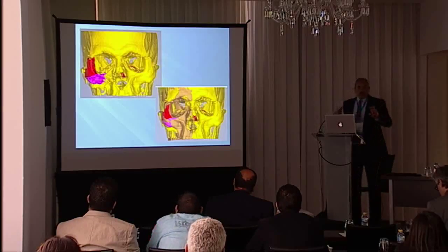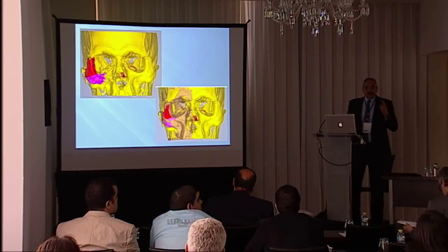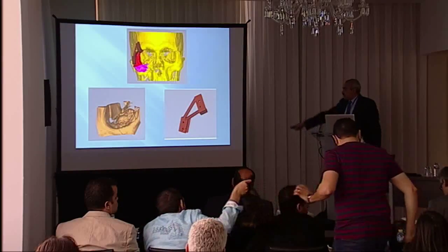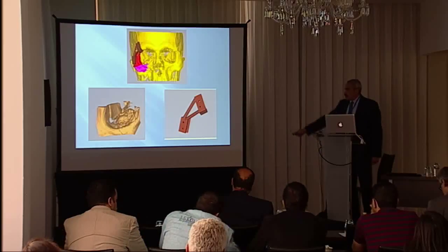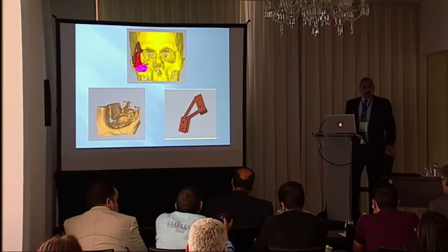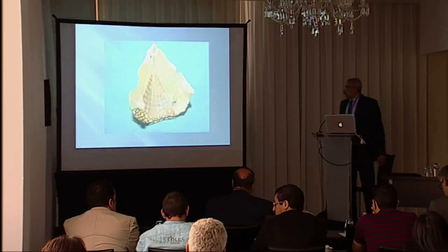Then we start putting the puzzle in place inside the zygoma, to end up with right and left identical zygomas, and we fabricate a series of stents that would fix the bone to the desired position. I also printed the orbital floor in 3D to do the orbital mesh contouring before the surgery.